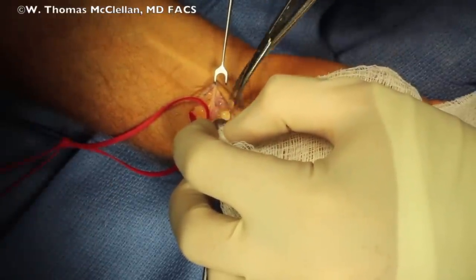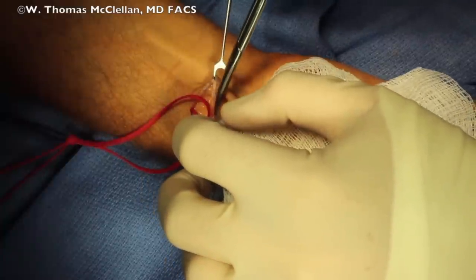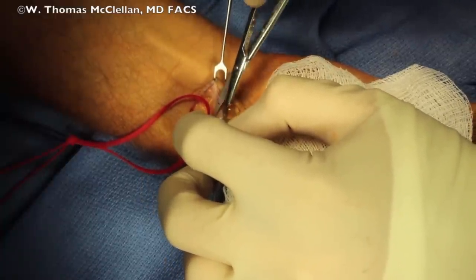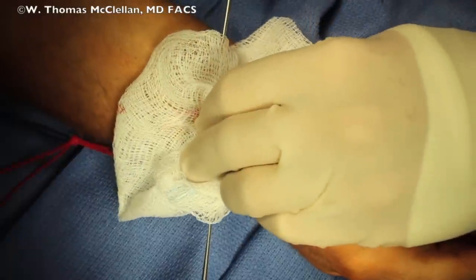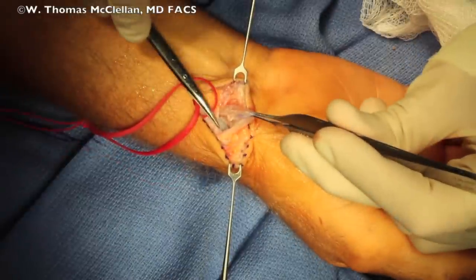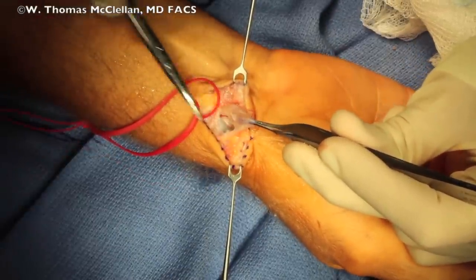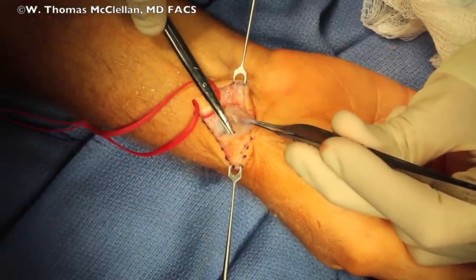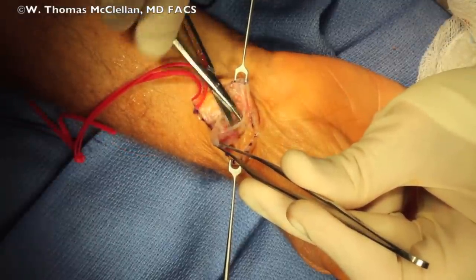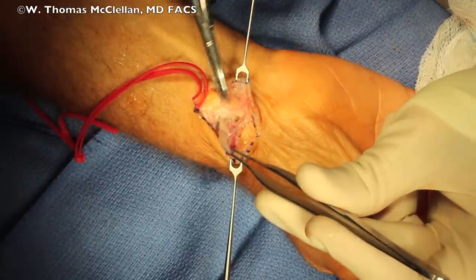It's impossible to really dissect these out without getting into them, and as you'll see here, I have the cyst rupture as I try to get around it. I take out all the fluid from the cyst by squeezing it, and now it's a little easier to manage. I can dissect distally right on top of the radial artery and then come medially along the flexor carpi radialis.